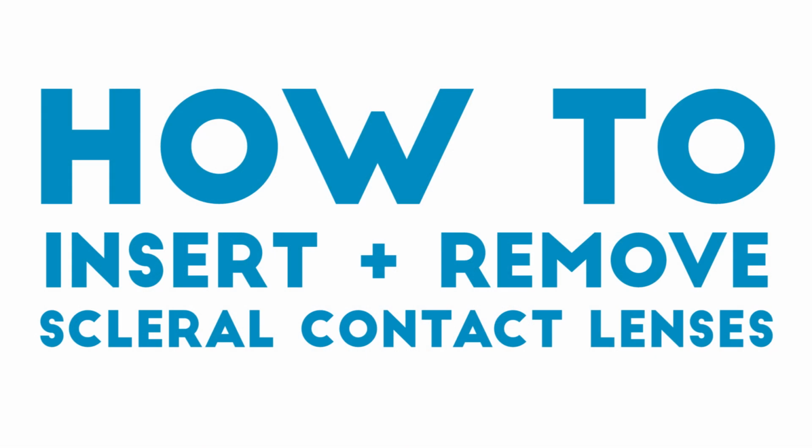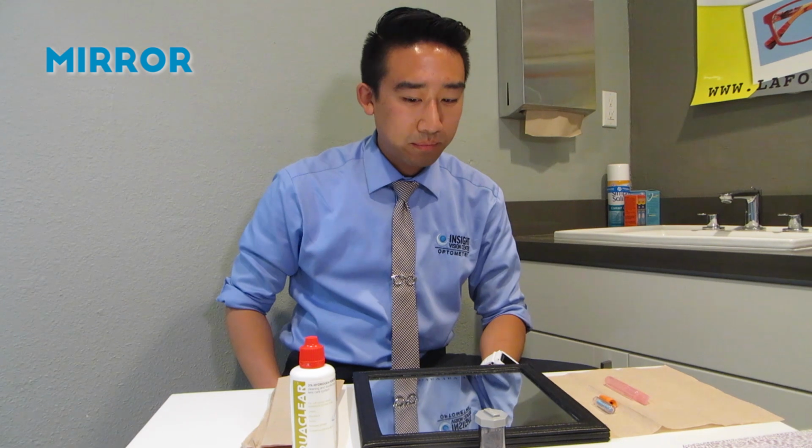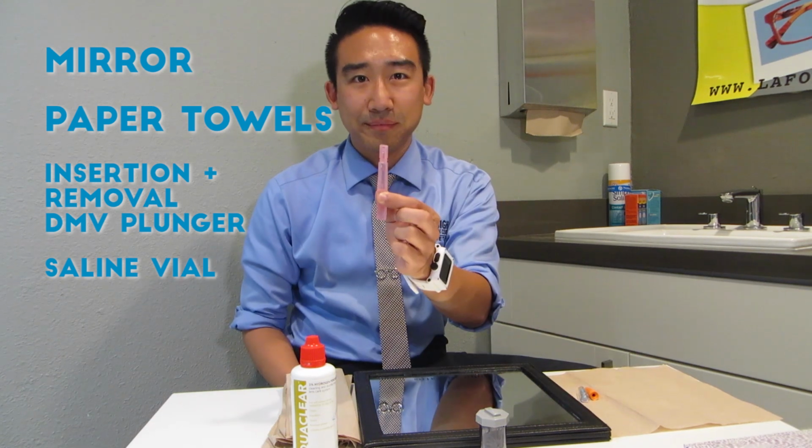Today we are going to teach you how to insert and remove your scleral contact lenses. For setup, you will need a mirror that can lay flat on the table, several paper towels, your insertion and removal DMV plunger, and a vial of preservative-free sterile saline.